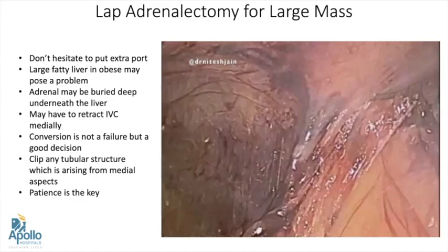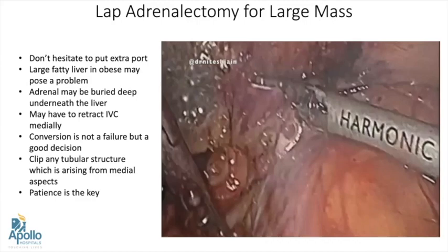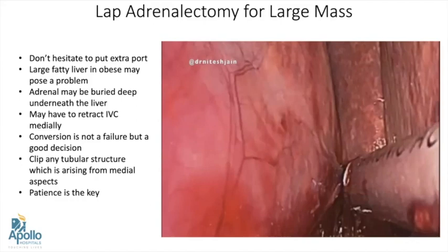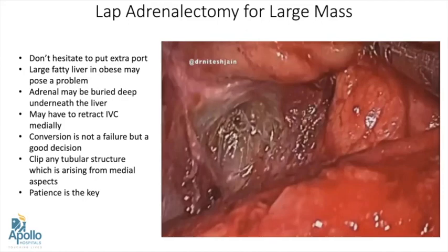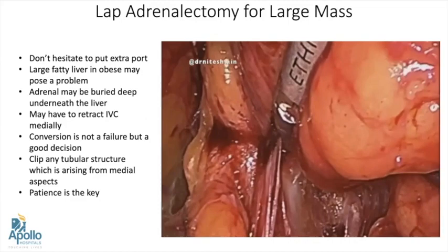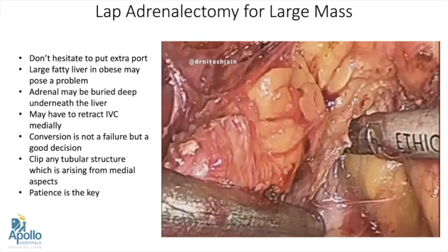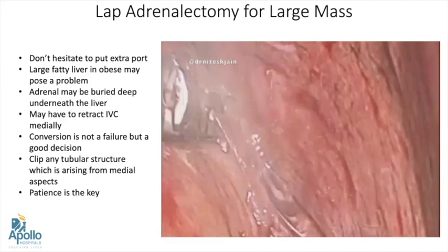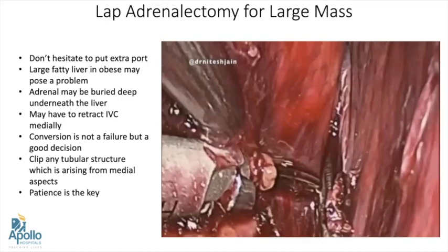Patience is the key in this form of surgery. Once the medial attachments are taken care of, the rest is usually easy. We need to start our dissection from the upper border of the kidney — identify the kidney and retract it downwards with the left hand. Once that is done, all other attachments can be tackled with the help of the harmonic and the mass can be entirely mobilized. We need to give constant traction onto the mass either with the help of an extra port or with the right hand. Once the mass is completely mobilized, it is a very, very rewarding surgery — especially when the mass is very large.